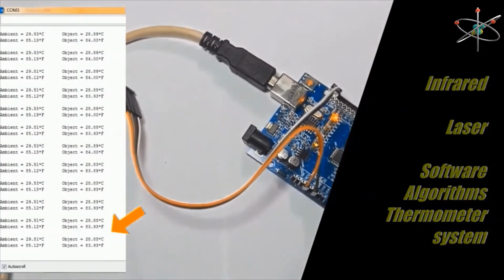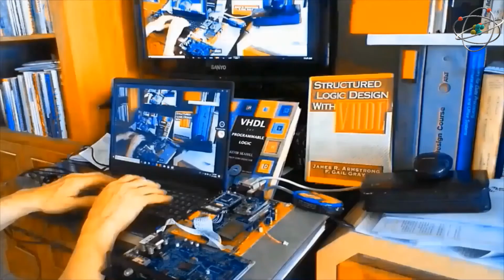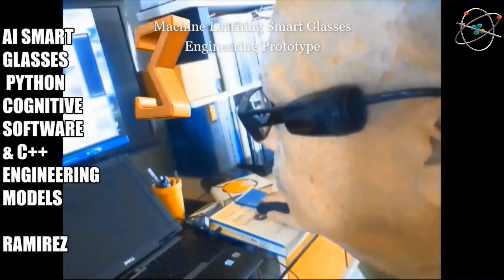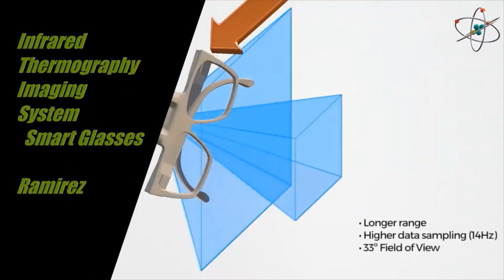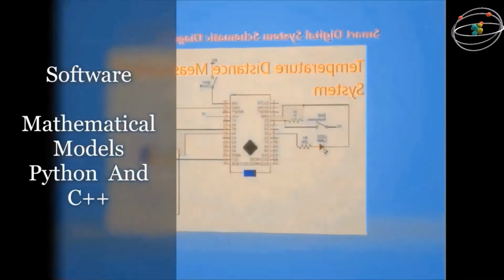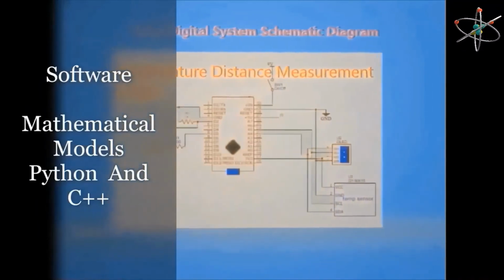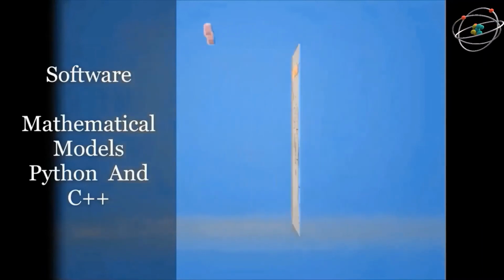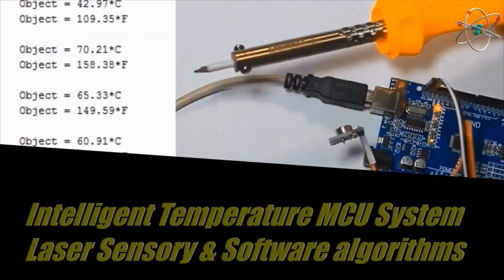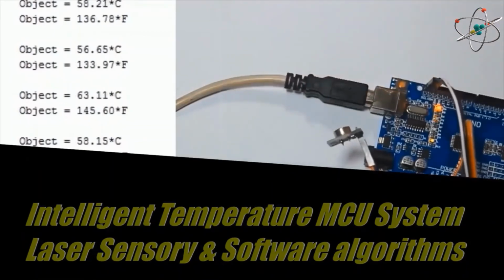Therefore, as the temperature rises, the radiation peak shifts to the short wave. The rate of change of radiant energy with respect to temperature is larger at the short wave than at the long wave.